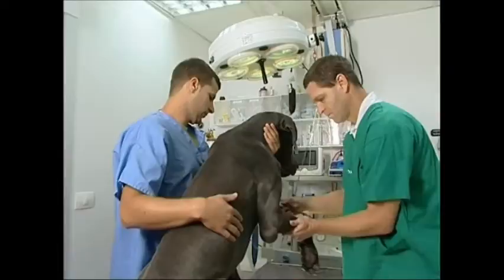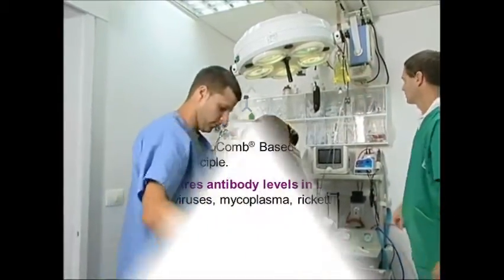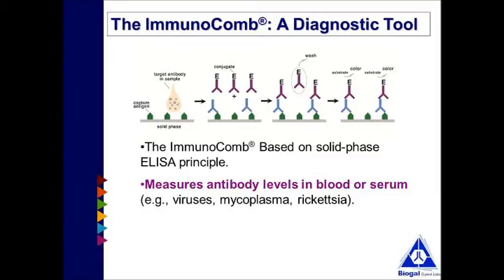Biogal's ImmunoComb Kit is a quick, simple and portable dot ELISA based test. The ImmunoComb provides quantitative, semi-quantitative and qualitative results.